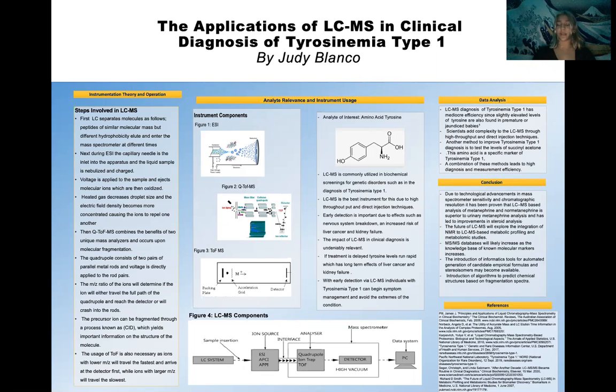ESI is then employed prior to MS analysis. During ESI, the capillary needle is the inlet into the apparatus, and here the liquid is nebulized and charged. A voltage is applied to the sample, and the ejected molecular ions are oxidized upon entering the desolvating capillary. Evaporation from heated gas decreases droplet size, and the electric field density becomes more concentrated. This causes the ions to repel one another, separating positive and negative charges. The fragmented molecular ions then travel to the entrance of the mass analyzer for analysis.